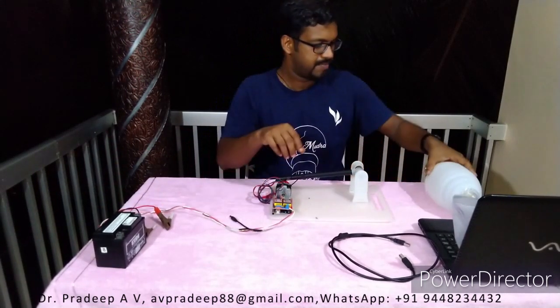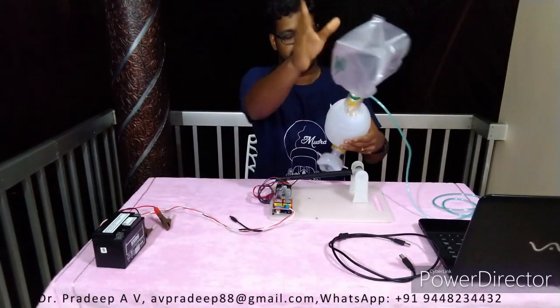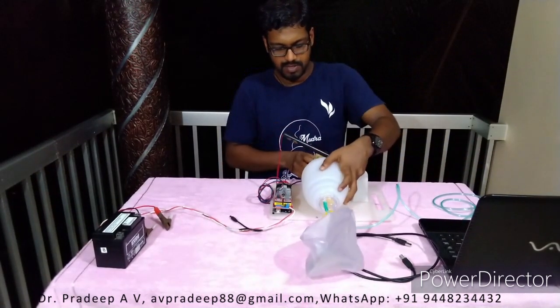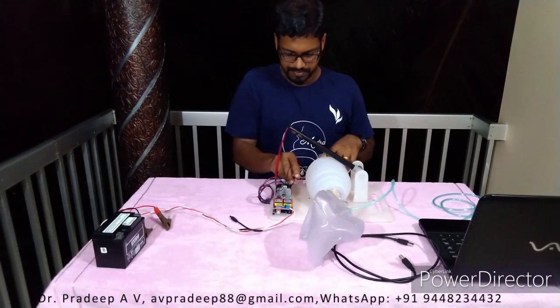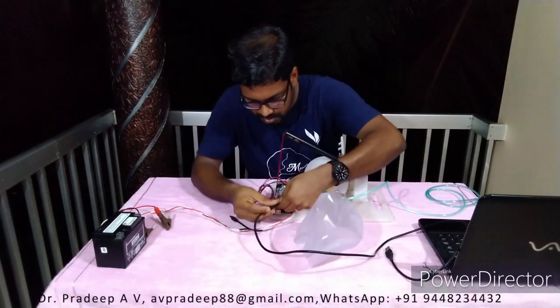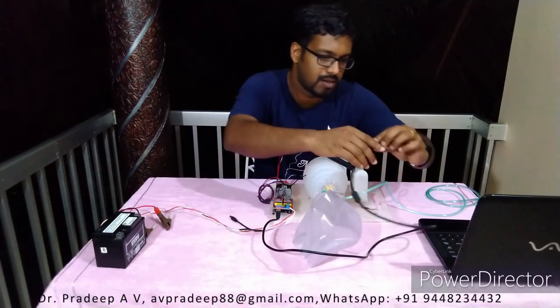So it's here, and the AMBU bag. This is supposed to be inflated. Fine. I'm going to sit it like this. Now I have to program it. So this I'll hook up to a PC.